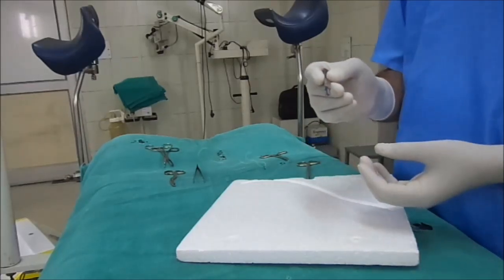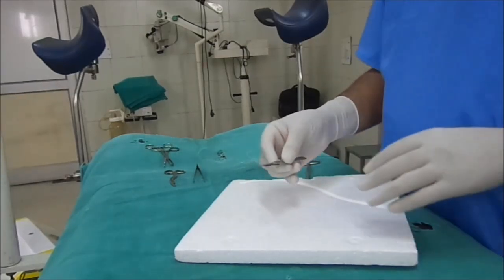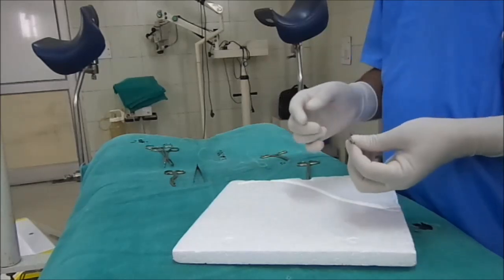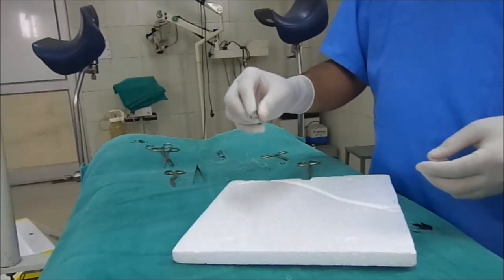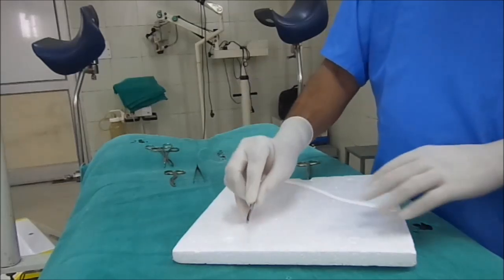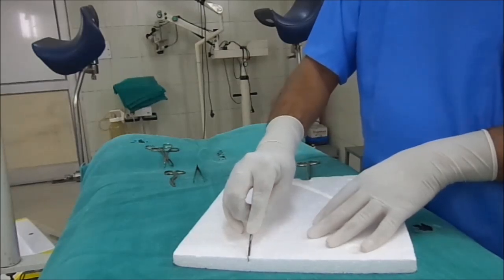This is the number 24 surgical blade. While making an incision in the abdomen where more pressure is required, we usually hold the scalpel in this direction and then make an incision like that.